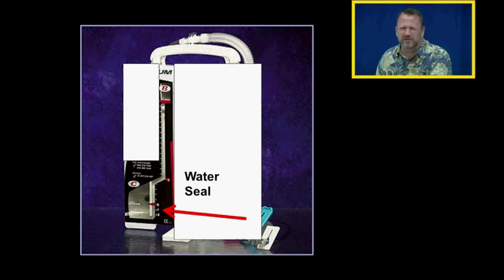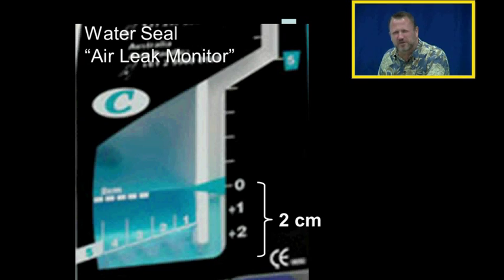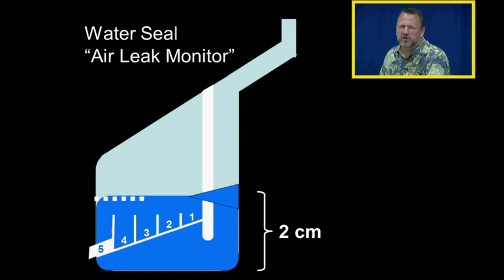Here's the water seal for this system, although they call it the air leak monitor because they have a separate check valve for that function. This is the new graduated air leak monitor, and notice it's submerged in two centimeters of water, just like any water seal. There are five columns where air can escape from the water seal. With a small amount of air leaking, we see air moving through only column one.